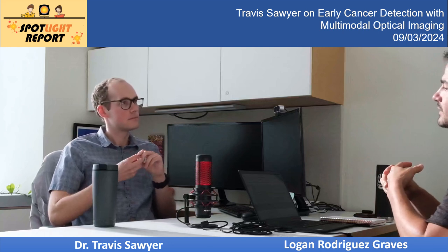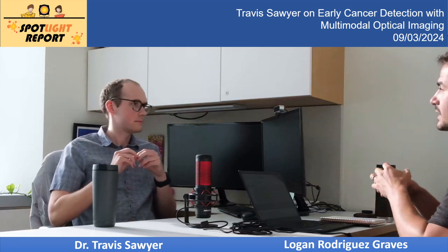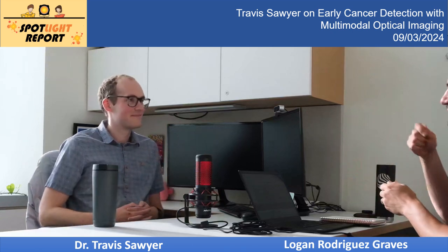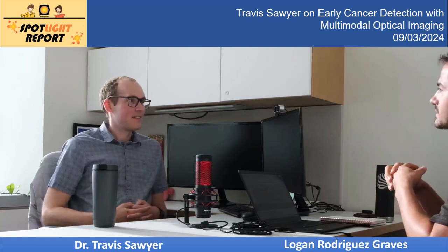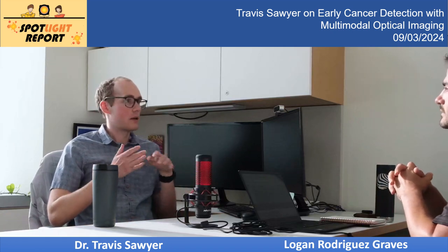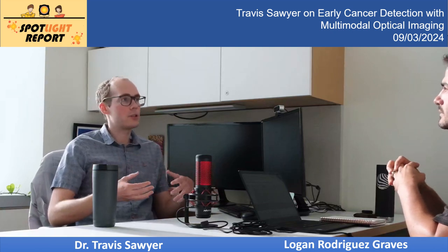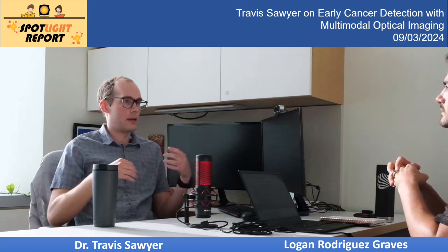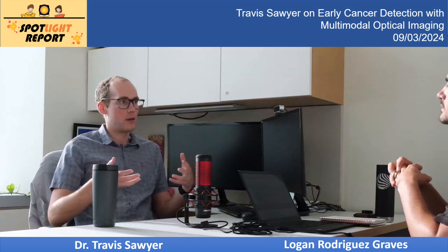So what is it about cancer cells, and particularly these epithelial cancer cells, that makes them good candidates for optical methods? Besides the fact that, if I'm sticking something inside my body, I want it small, we can do that with fiber optics, but why else would you use optics? Yeah, sure. I think this gets into really why I'm so fascinated by this field. And I could answer that in a couple of different ways. First, an obvious one, which is resolution. If you're looking for really small lesions, on the order of a couple millimeters, and you use a larger scale imaging modality like MRI or ultrasound, you might not have enough resolution to actually resolve the lesion you're looking for.